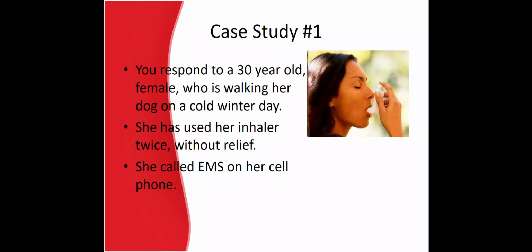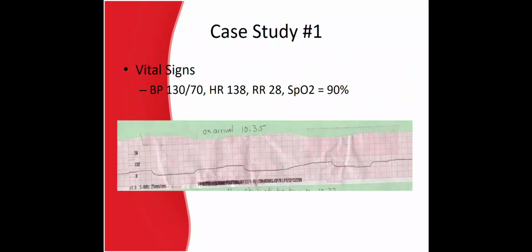You respond to a 30-year-old female who is walking her dog on a cold winter day. Cold air can be a trigger for some asthmatics. She has used her inhaler twice without relief. She called EMS from her cell phone. Her vital signs are listed. The end-tidal CO2 waveform has a shark fin appearance. What does this waveform indicate?